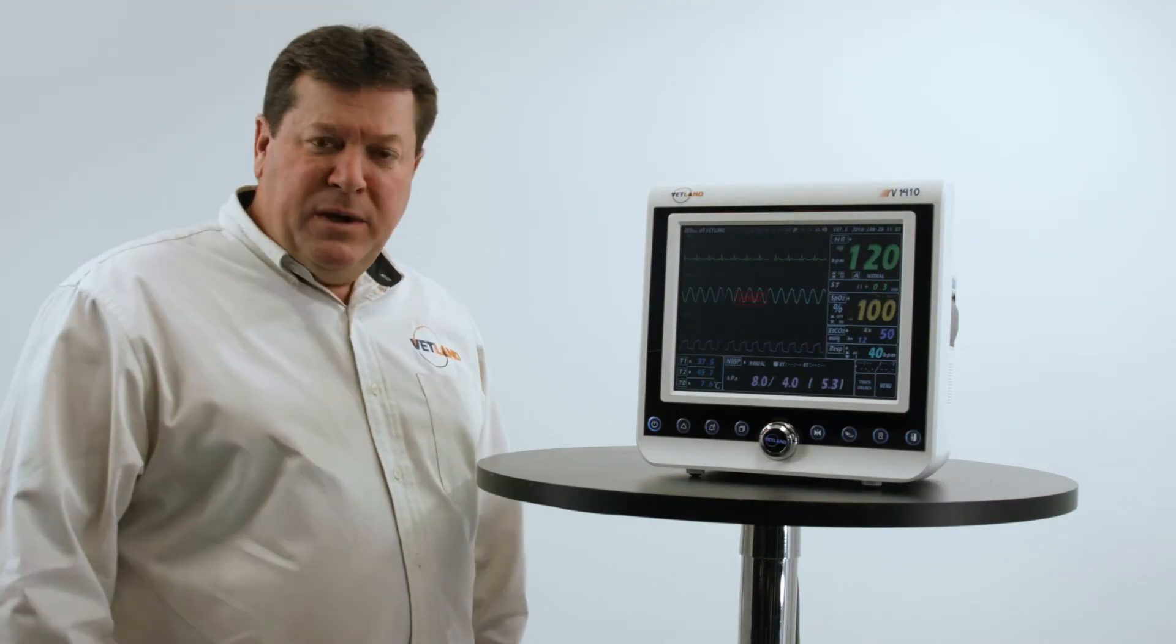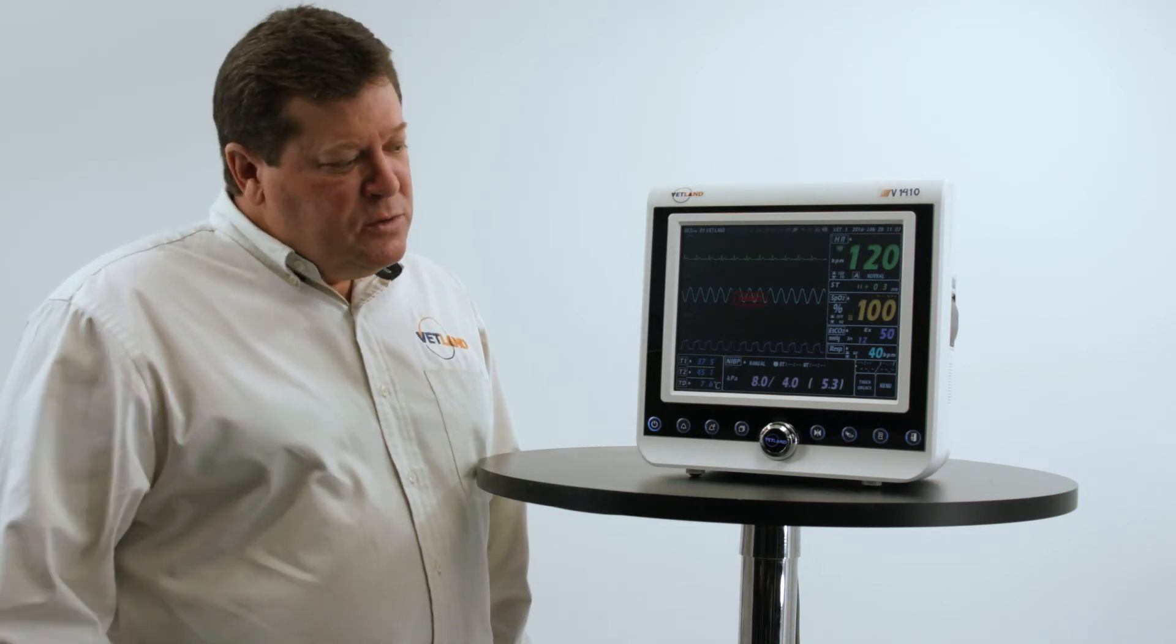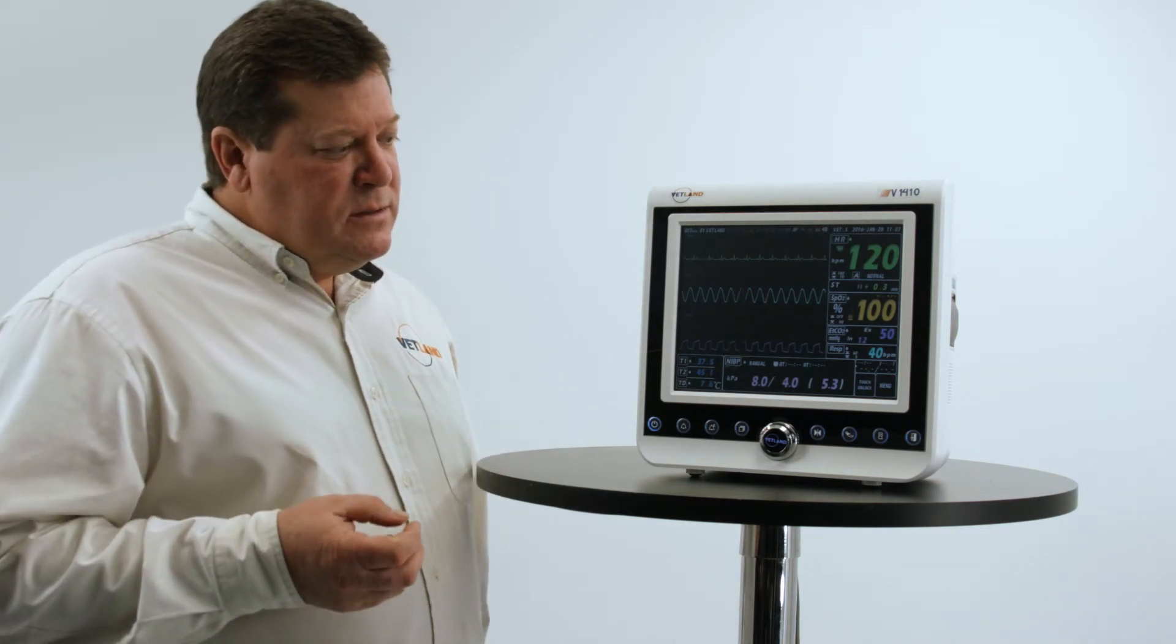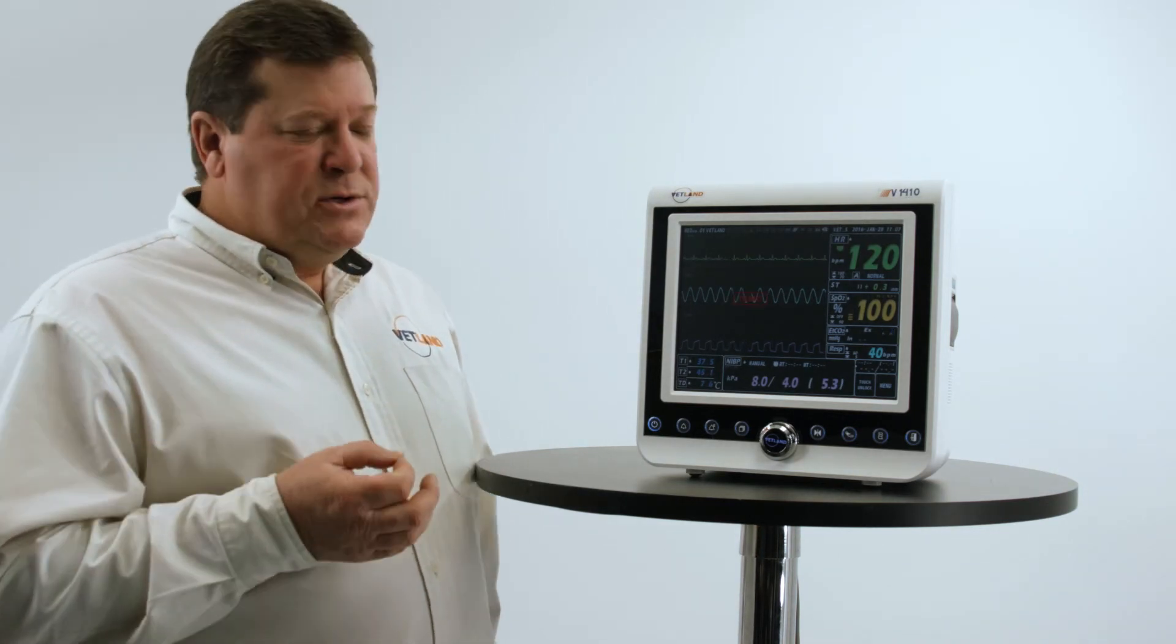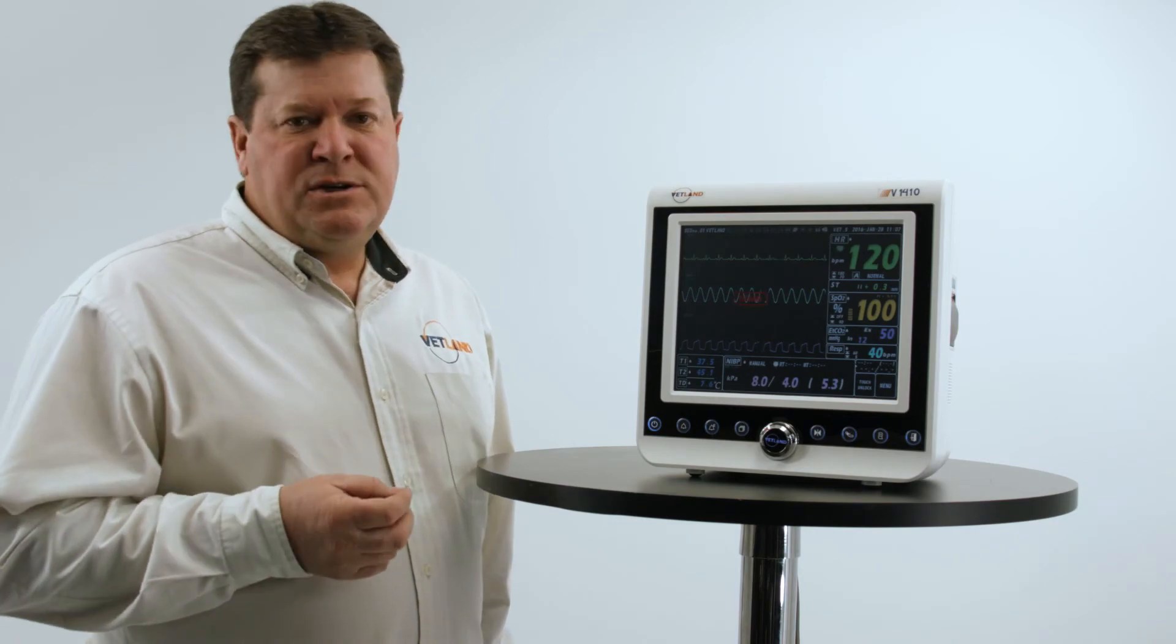Compared to competitors' monitors, you'll be able to get a larger display and more function for the same money that you would spend for competitive monitors.